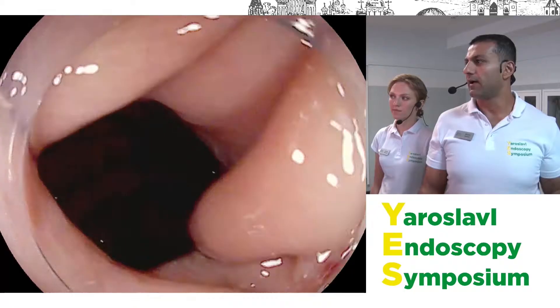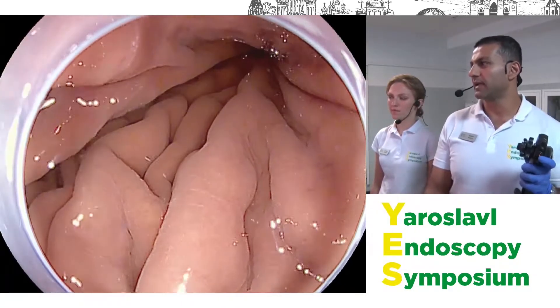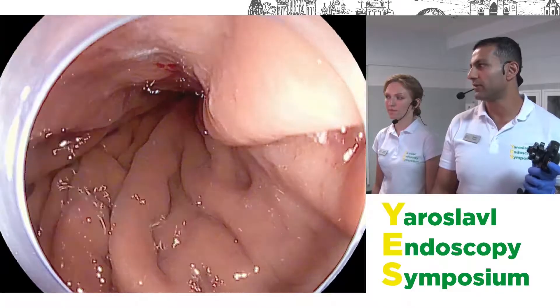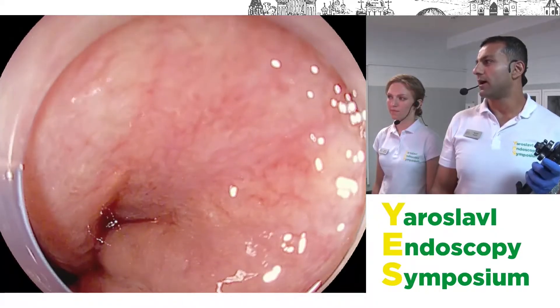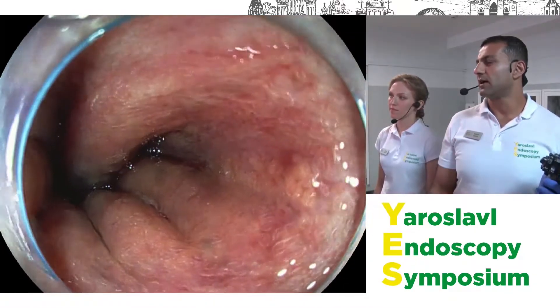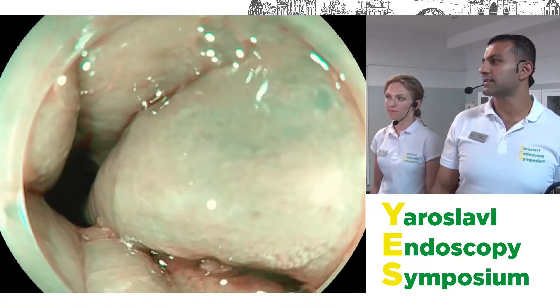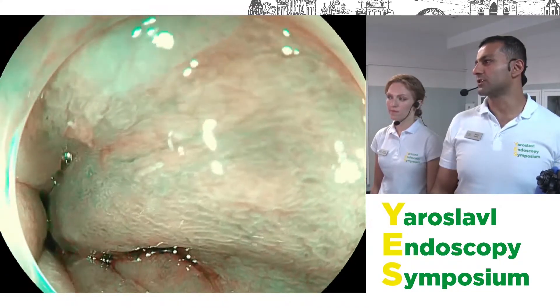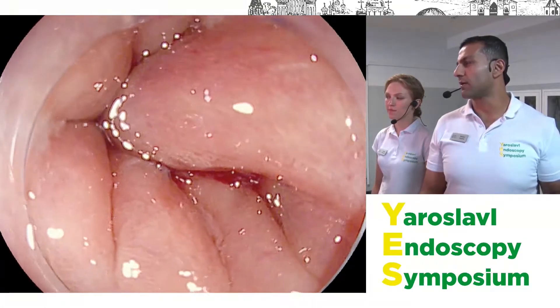Going back to the Prague classification for Barrett's esophagus, we start by looking at the hiatal hernia — 80% of these patients will have one. The key is to wash: before we came on air we used mucolytic agents to wash the surface. Then we define where the top of the gastric folds are. You can see the distinction between round cardio-type pits and the long metaplastic-type pits. In Japan, palisade vessels also help differentiate stomach tissue from esophageal tissue.